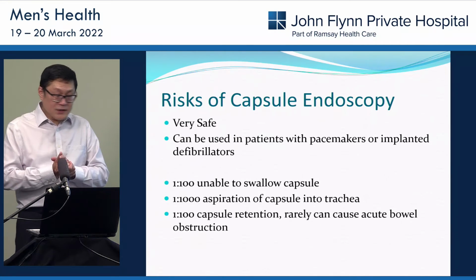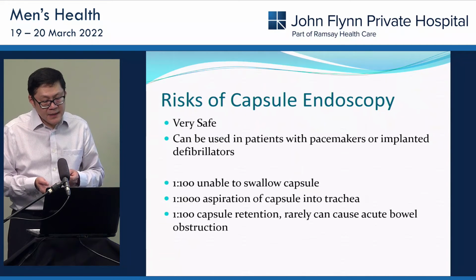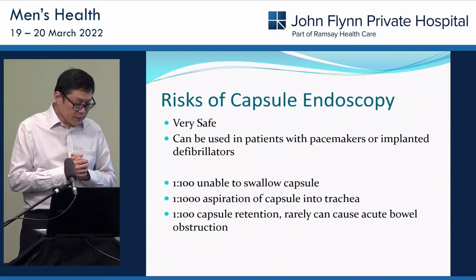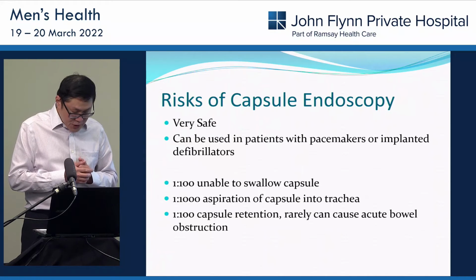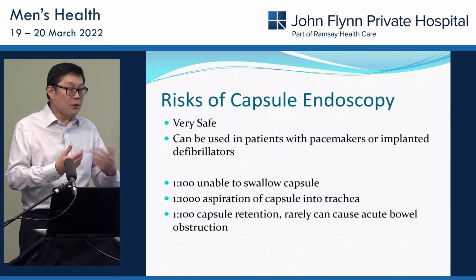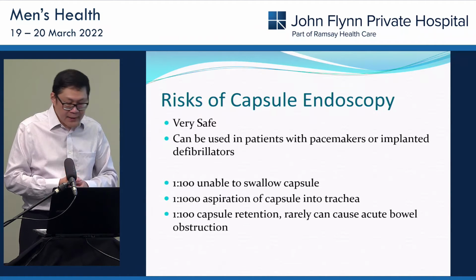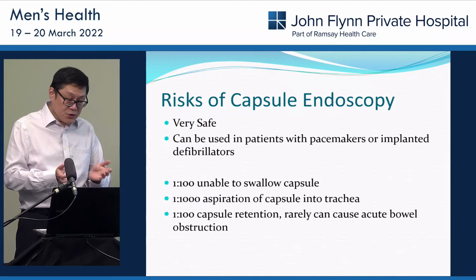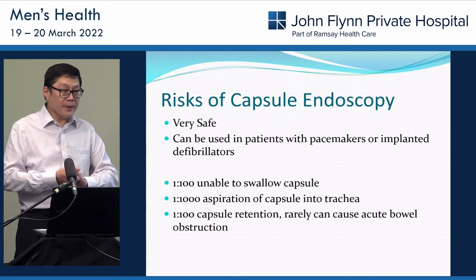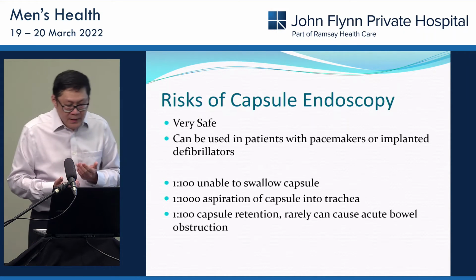Now, it is actually very safe. It can be used in patients with pacemakers and implanted defibrillators. There are obviously a small percentage of patients who are unable to swallow the capsule. These are mainly patients with pre-existing swallowing disorders, strokes, neurological disorders, or previous strictures or damage to the upper GI tract. So in situations like this, we can deploy the PillCam endoscopically. There's a device that allows us to push it down into the small bowel.